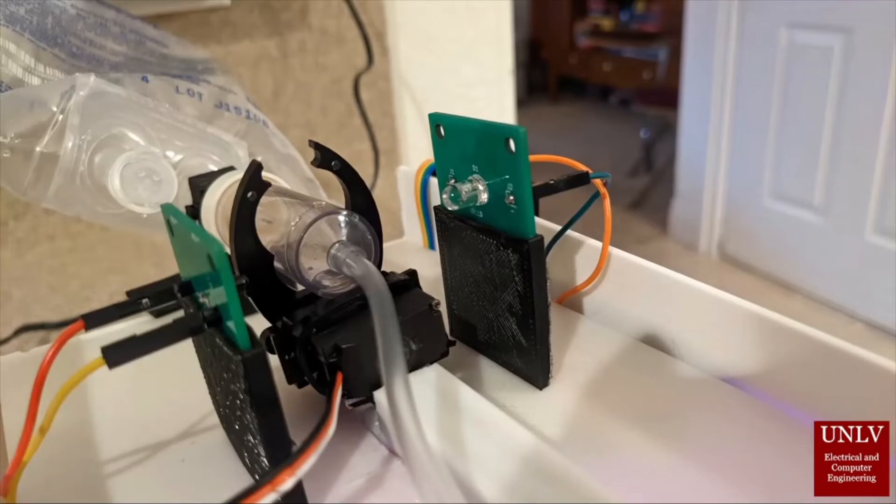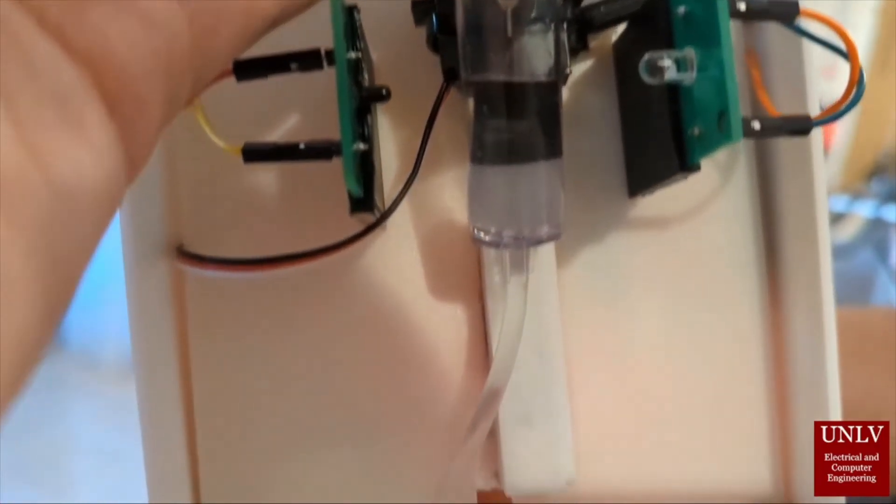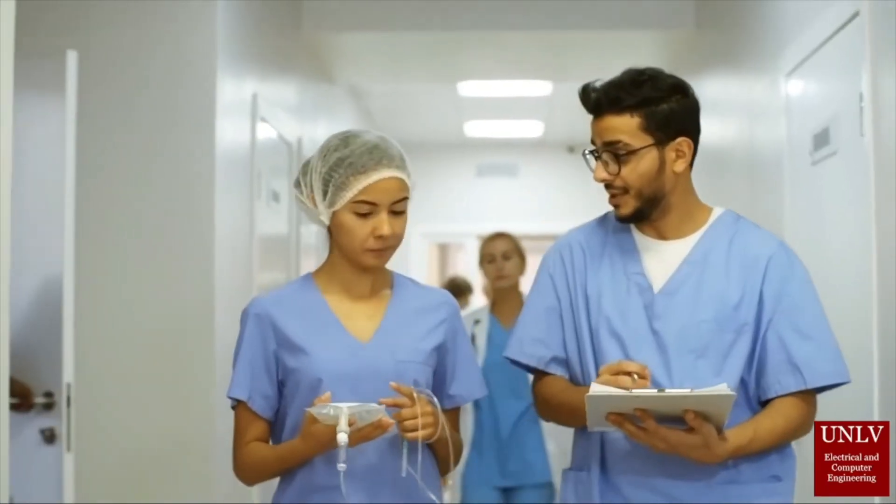This is our IR sensor, which gets the drip rate every time it drips. We perform calculations in our microcontroller to determine the flow rate and manipulate it with a motor. You can see the drops here — this LED signals every time a drop passes through, and that signal is sent into our microcontroller.